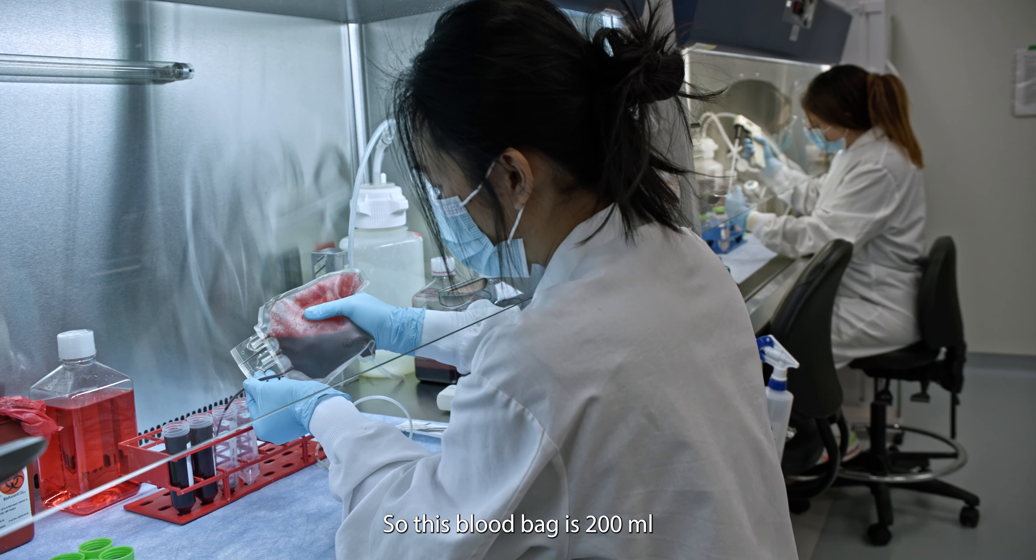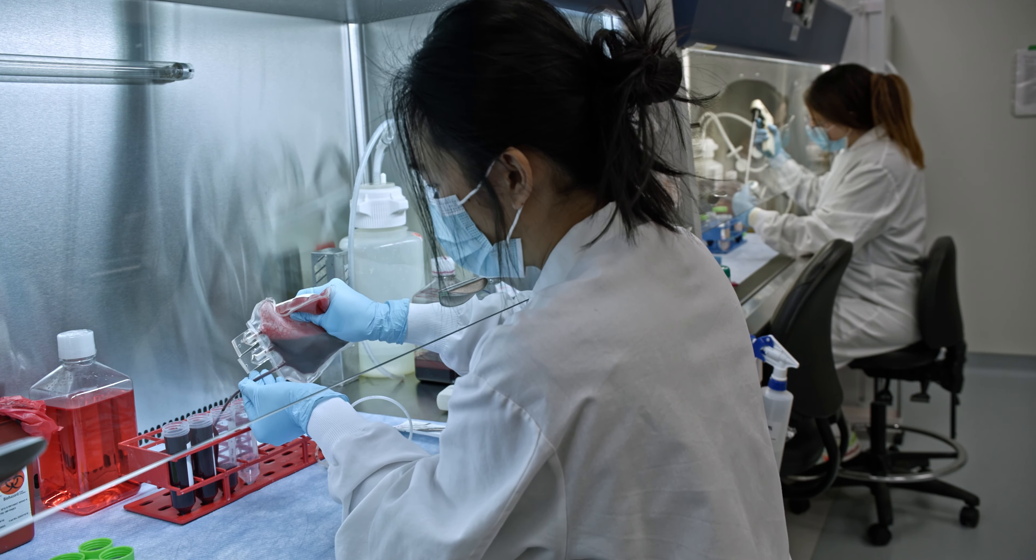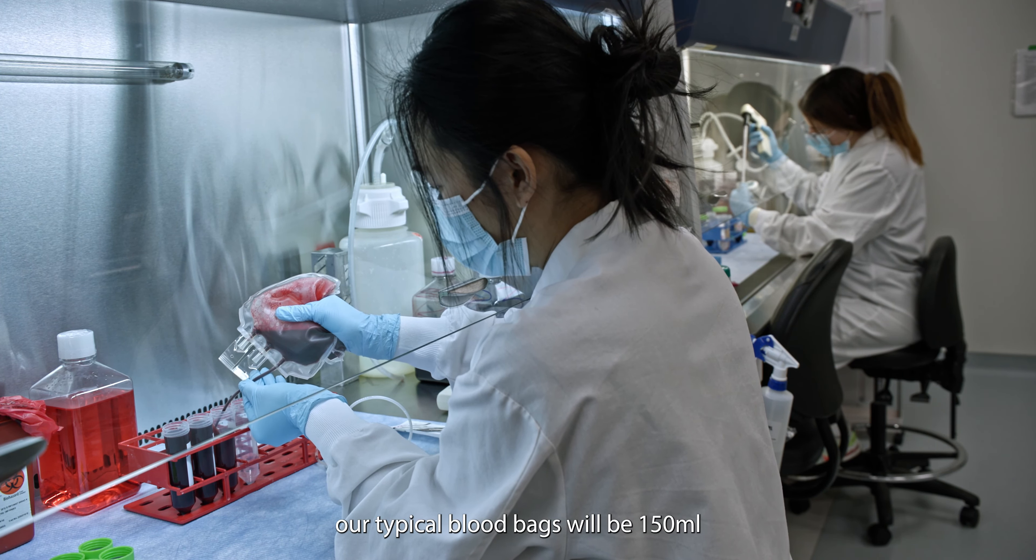So this blood bag is 200 mls. Our typical blood bags will be 150.